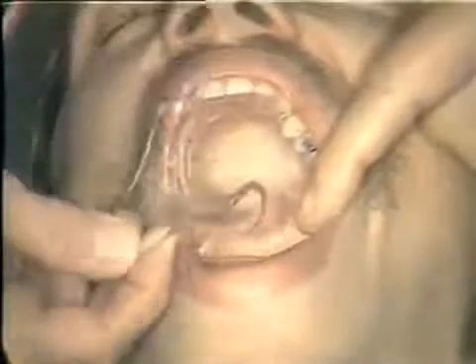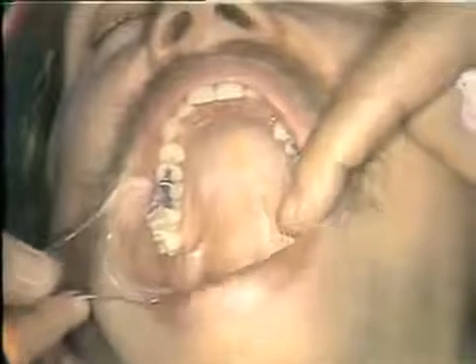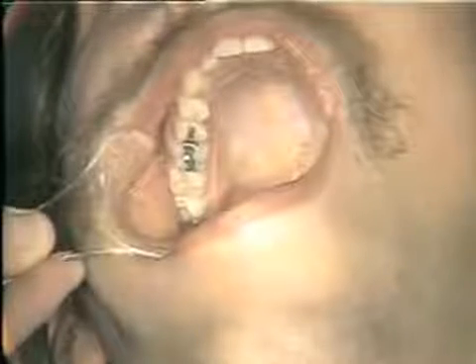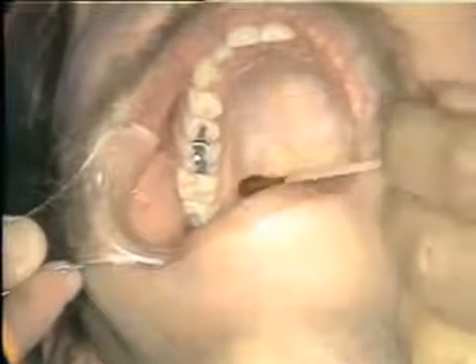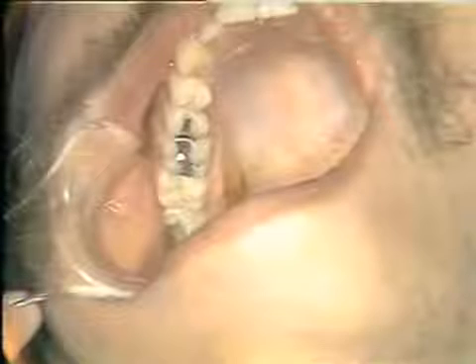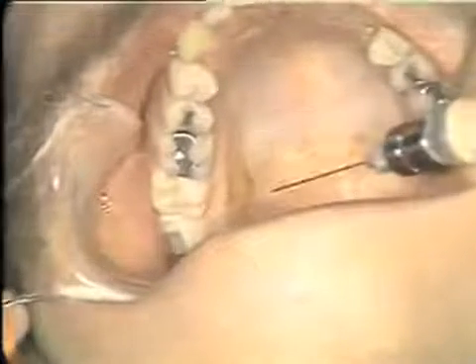All right, let us show you the anterior palatine injection on Mr. Fry. And if you'll open real wide for us. Oh, that's great. Now we'll dry the mucosa here first in the usual fashion. Just resting it there for a few moments, and then we'll apply a little betadine in our injection site. And now we'll make the approach with our syringe.